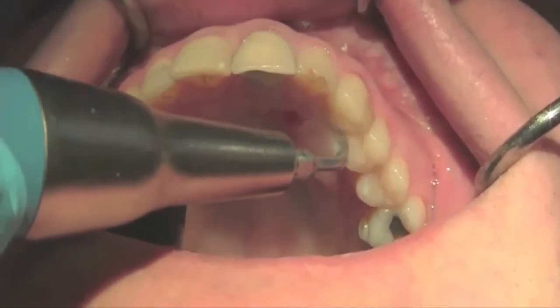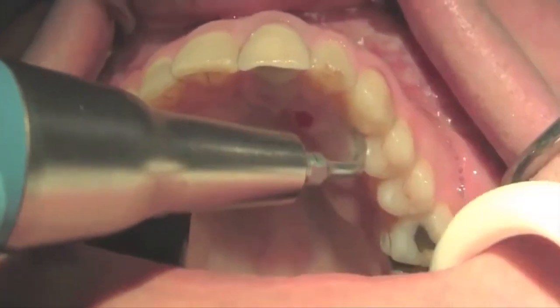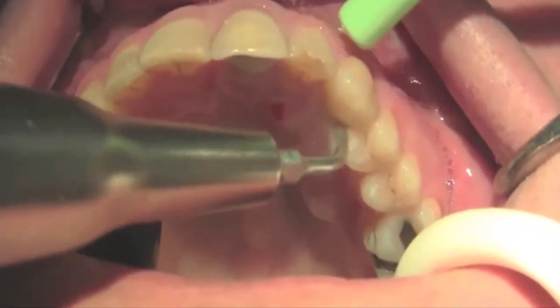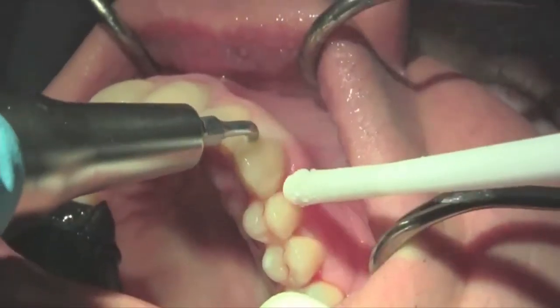So we started the atraumatic extraction process utilizing the piezotome. The piezotome is one of the piezo devices available in the market for piezo surgery, and they have an excellent system or an excellent distribution of tips for atraumatic extraction, very thin and long tips that can be utilized to penetrate the periodontal ligament. Most of the companies that have piezo devices in the market also have available tips for the same purpose, penetration through the periodontal ligament.